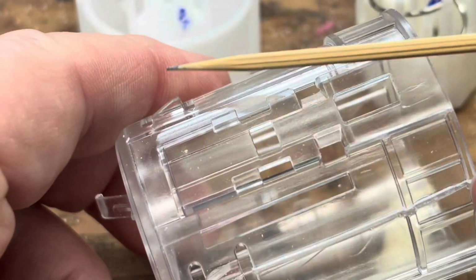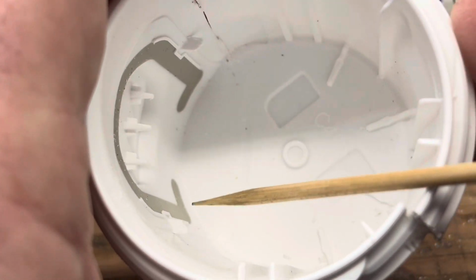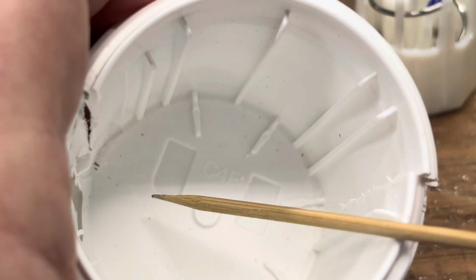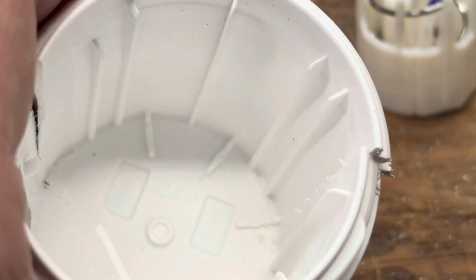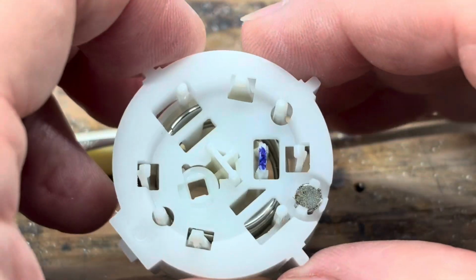Also notice there's 2 tabs here and here, and that correspond. This is cup 1. There's 2 tabs in cup 1 here and here, and this is the button that triggers the mechanism. These recesses are where the plastic springs in cup 2 reside. Okay, now I'll reassemble the device and explain how the pieces work. Okay, this is units 3 and 4 reassembled.